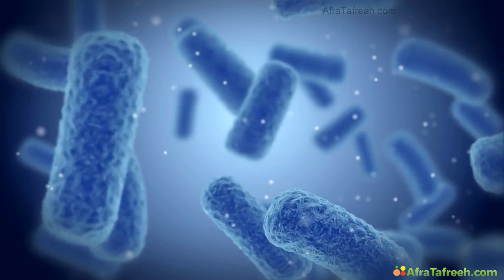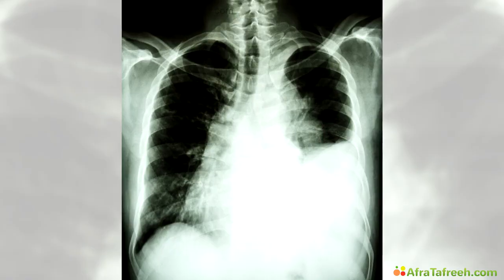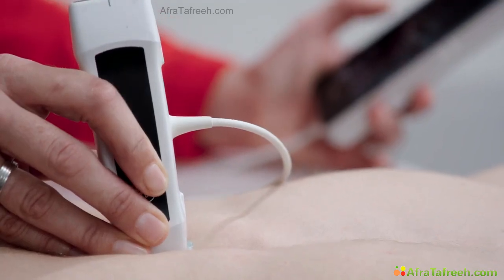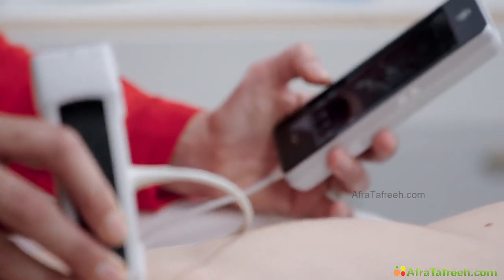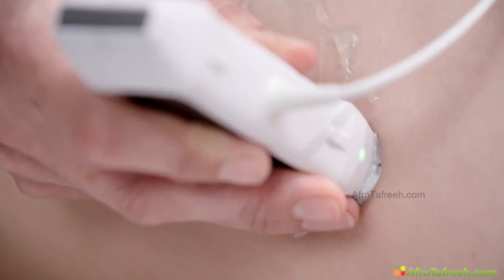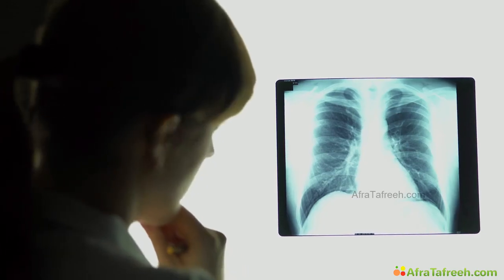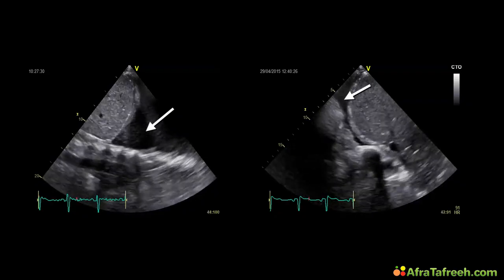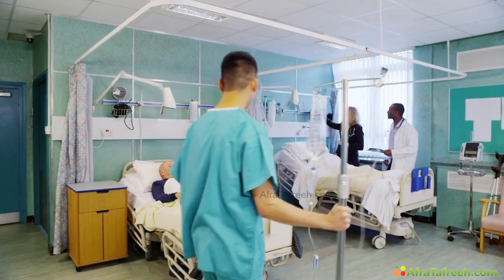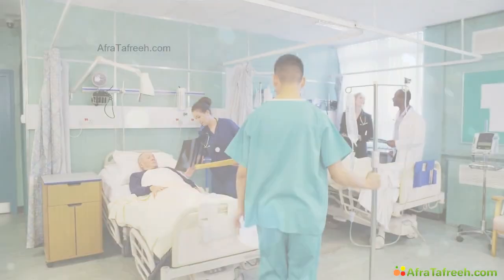Indeed, there are many respiratory diseases that can cause dyspnea: COPD, pneumonia, lung cancer, and pleural effusion. Especially pleural effusions are easy to detect with ultrasound. It can be applied in a primary care setting, for example, with the help of a handheld device. When it comes to pleural effusions, ultrasound is more sensitive and specific than the chest X-ray. Even small amounts of fluid can quickly be detected. This is important since early diagnosis and early treatment can save lives.